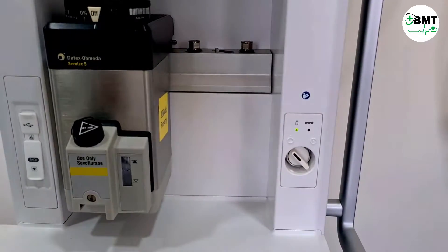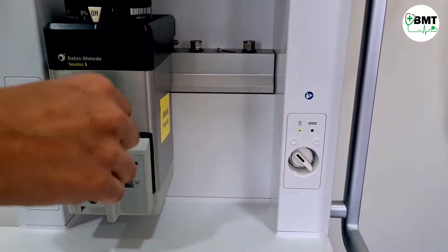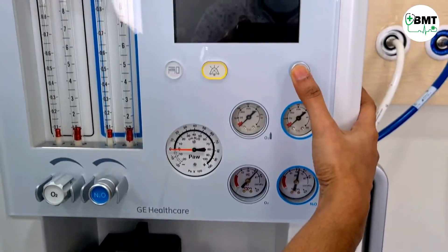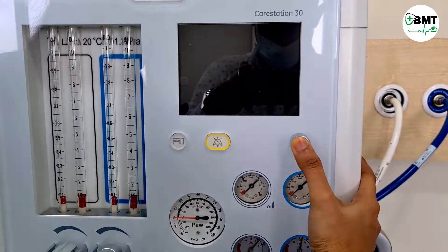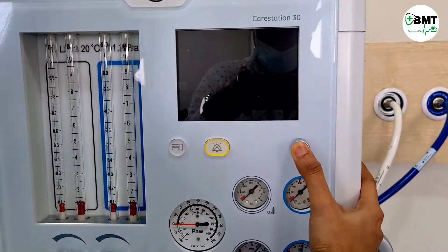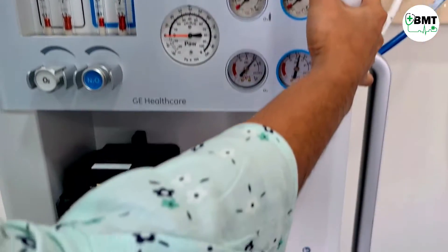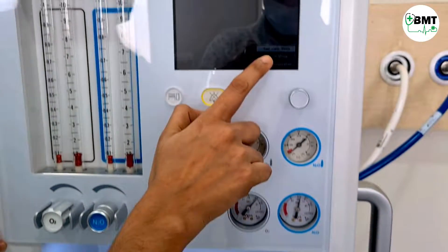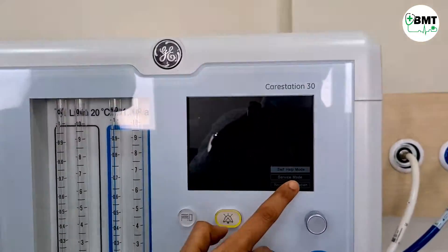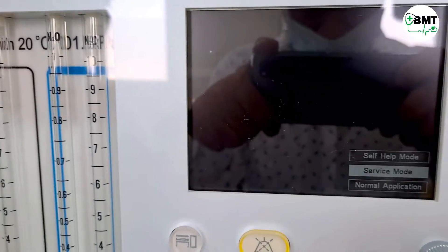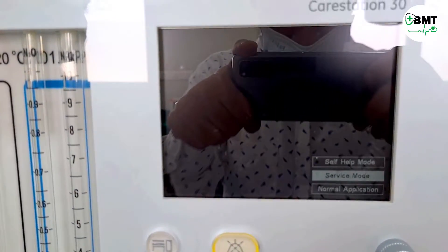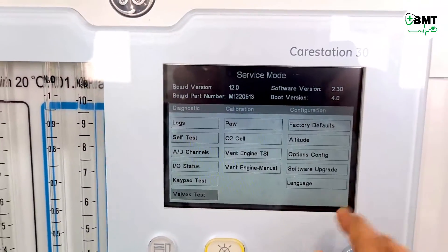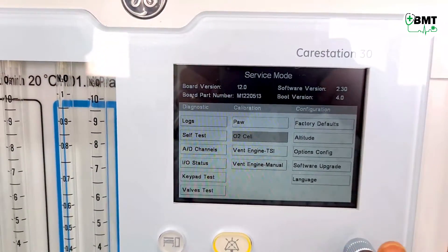For auto calibration, you have to go into service mode. Keep this rotary knob pressed and then turn on the machine. It will ask for service mode — go to service mode.